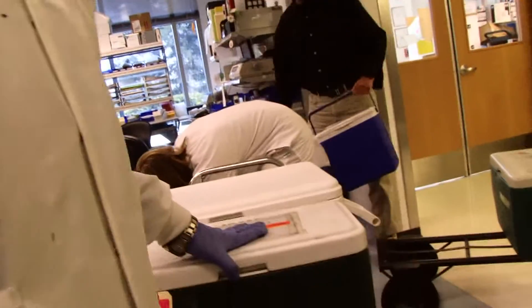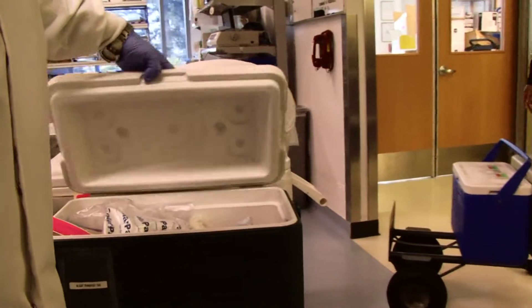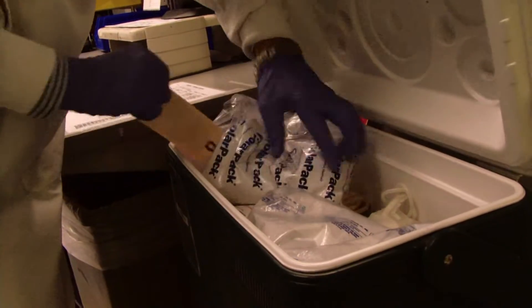Hi, my name is Tony and I work for Stanford Blood Center. I'm going to talk to you today a little bit about how we process our blood. We start off when we receive the blood here — we receive it in these coolers, different kinds of coolers. They come from different areas and here we have this tag that tells us what time they started drawing the blood.